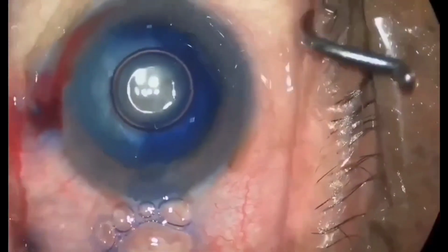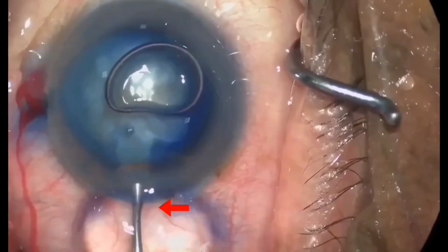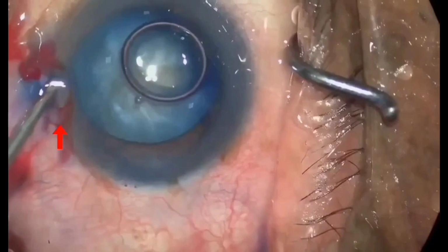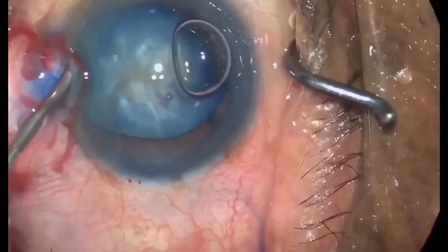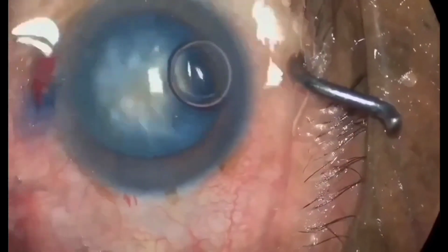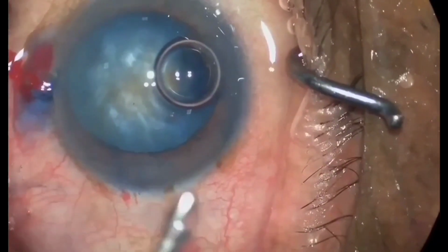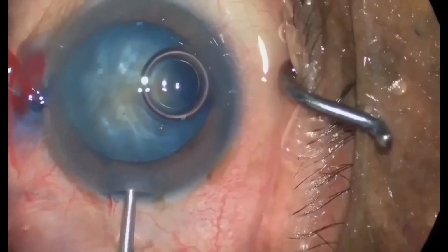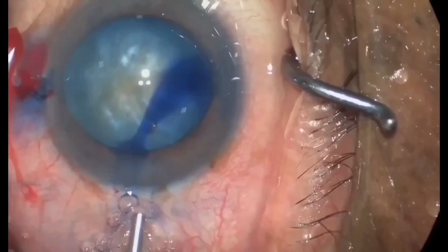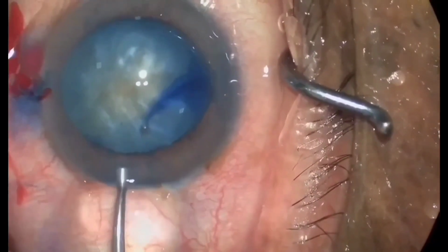The self-retaining eye speculum was loosened to relieve the positive pressure, and on injecting the viscoelastic, there was outward escape of the viscoelastic without any apparent deepening of the anterior chamber. Another attempt to inject the viscoelastic was made to deepen the anterior chamber, but there was outward flow of fluid from behind the iris without any deepening of the anterior chamber.